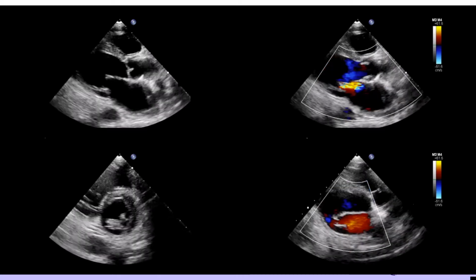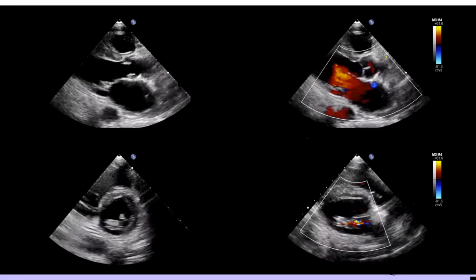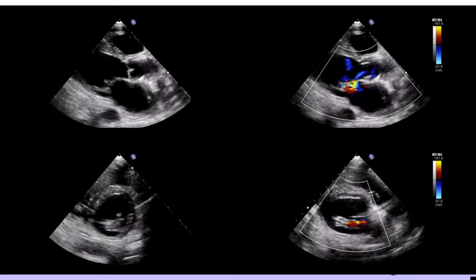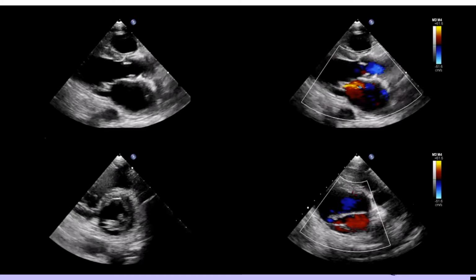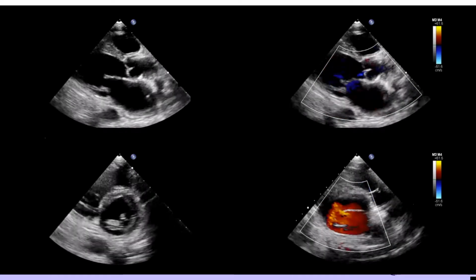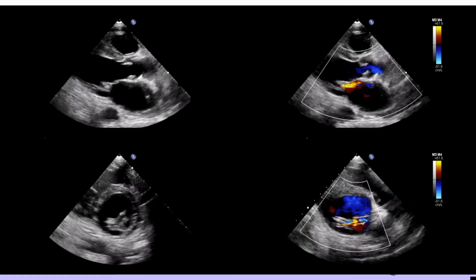The parasternal images confirm left ventricular dysfunction. The posterior wall is thinned out and akinetic. There was restriction of the posterior mitral leaflet. Moderate mitral regurgitation was present, which was directed posteriorly.